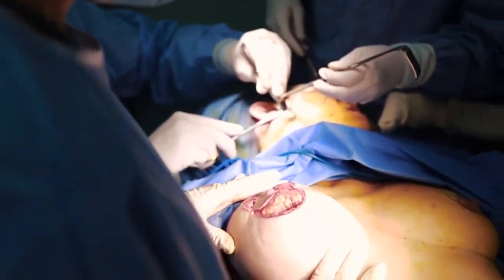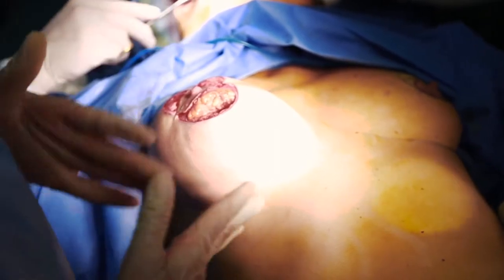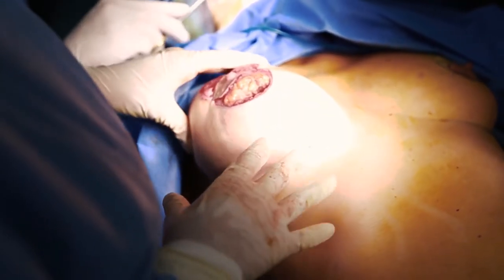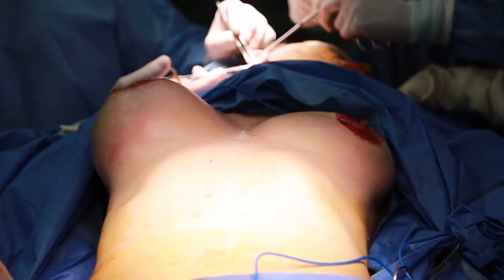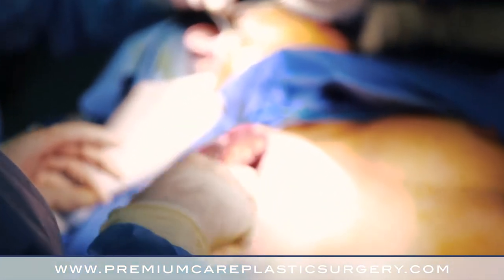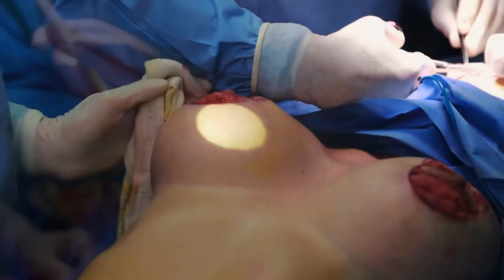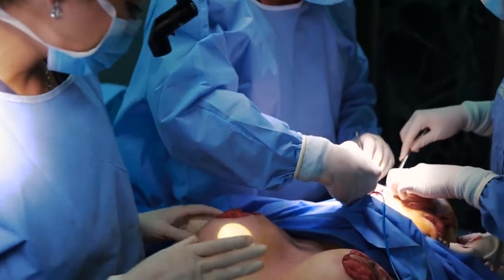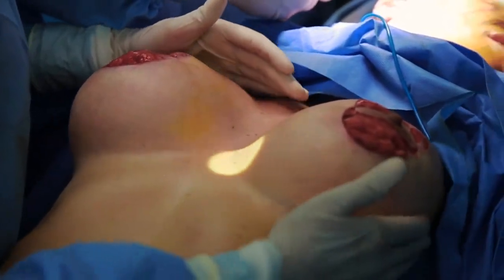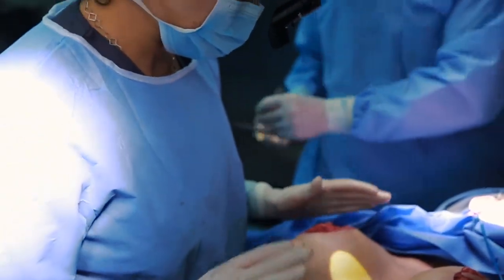What we have done here is the dissection of the pocket, and we placed a sizer that allows us to choose — with the information from the physical examination, the discussion with the patient, and the sizer here in the operating room — the perfect implant according to what we discussed and the best shape for the patient. On this side we have the sizer and on this side we have the final implant. We are double-checking that the pockets are dissected and the implants will look the same. After that we can start the closure to get done with the breast.